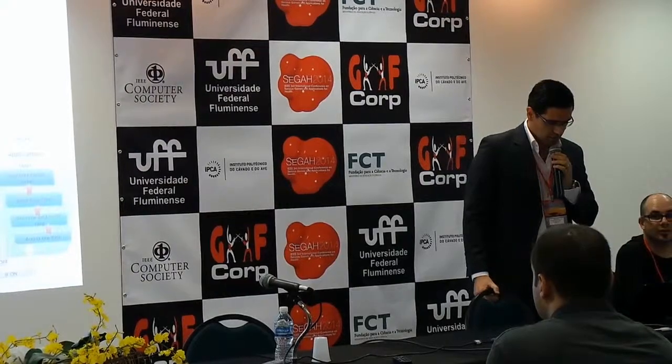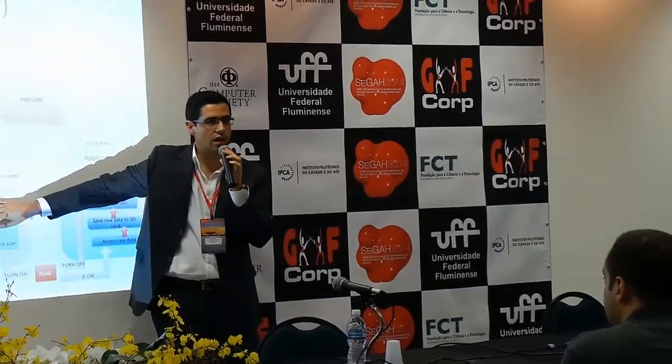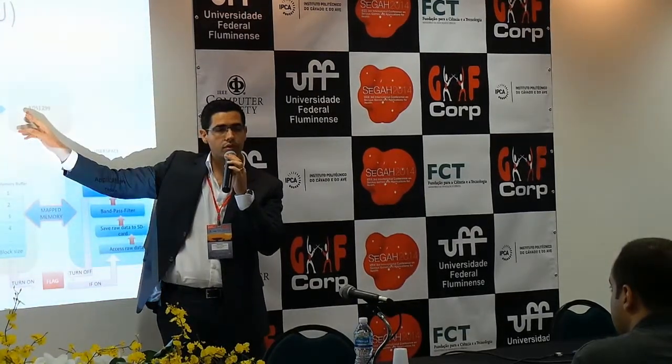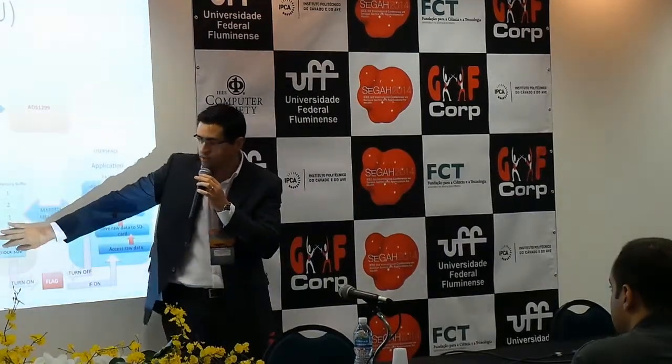This might be a bit technical, but I'll try to give a general overview. Regarding the functionality of this driver, you have the converter, which is the first place where you acquire your EEG data, and this driver is supposed to send data to the driver working on the embedded system. So you have bidirectional communication here, since you are receiving data, but first you have to configure your ADS so it works properly.